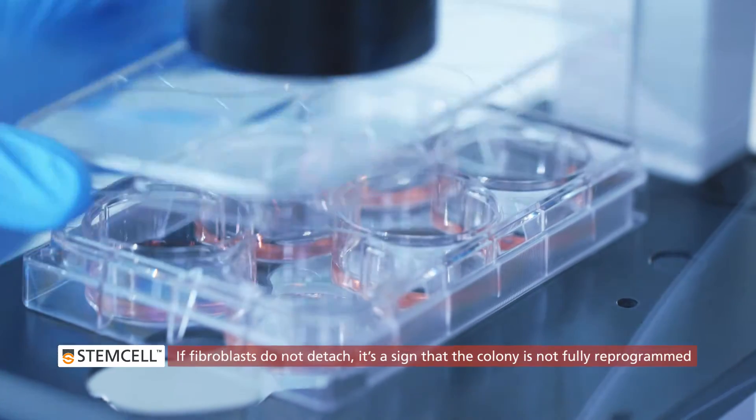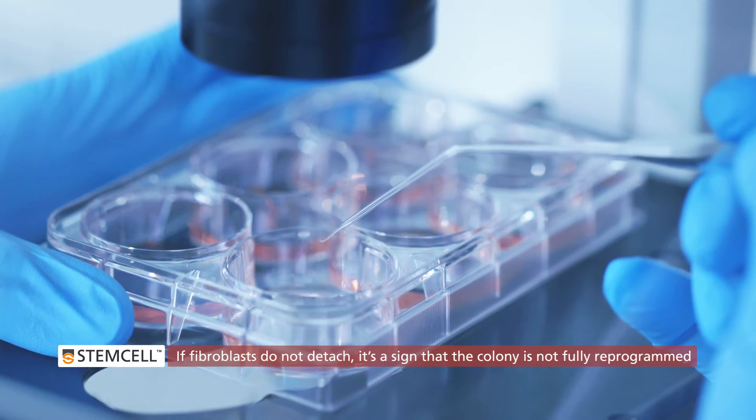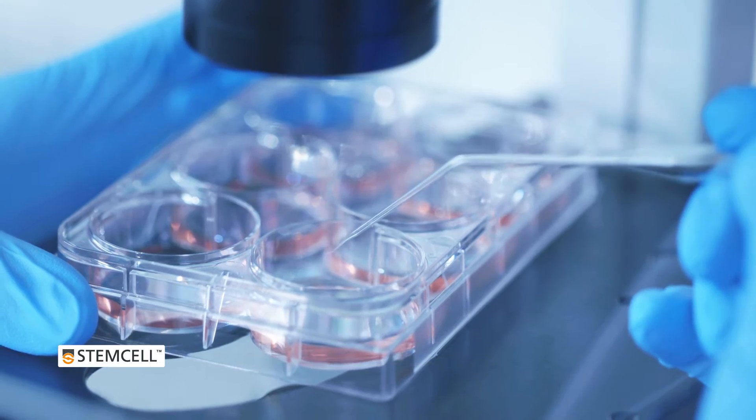If the surrounding fibroblasts do not easily detach from the colony, this is a sign that the colony may not be fully reprogrammed. It is recommended not to isolate that colony.